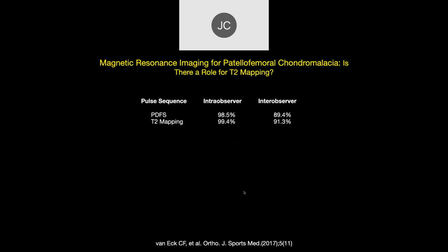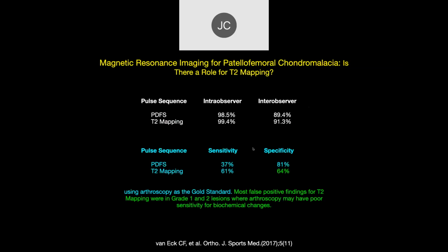This is a study that we published in the Orthopedic Journal of Sports Medicine. We looked at fat sequences of PD fat sat and T2 mapping to correlate the two. We found that there was very good intra-observer agreement in looking at pathology here using both techniques.